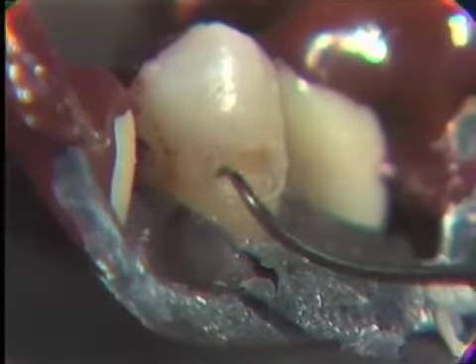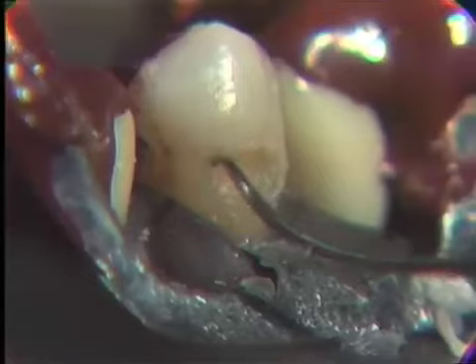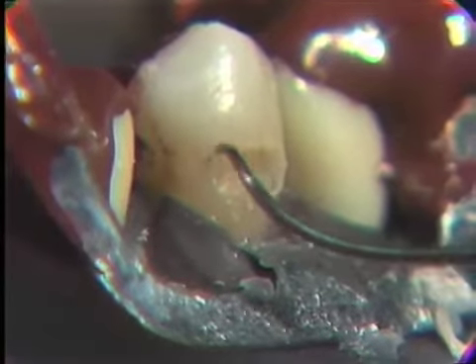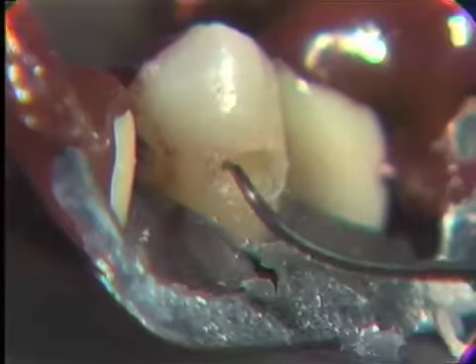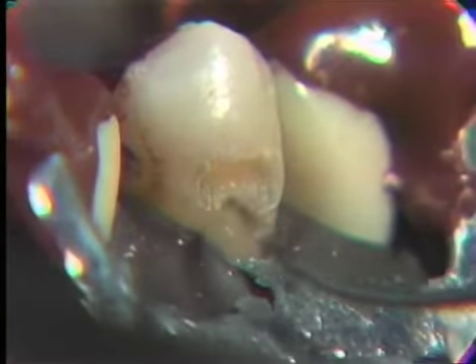Now we're checking the buccal surface of the enamel to see if any more structure must be removed to give good continuity to that enamel wall. And it appears that at the distal we have a bit of pitting at this point, and we'll want to extend over. Now at this point we're going into the final refinement of the extension.